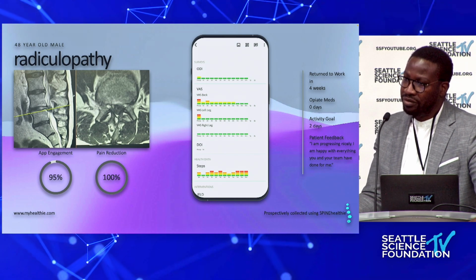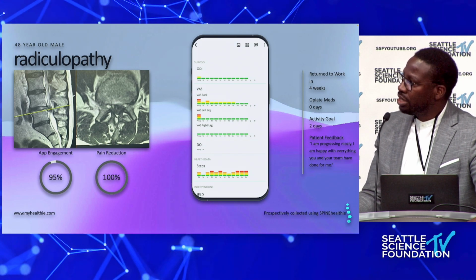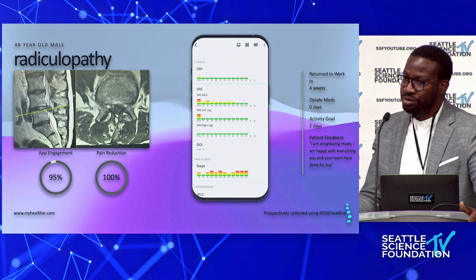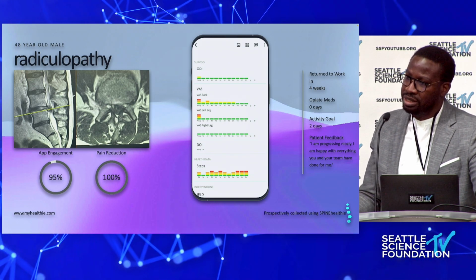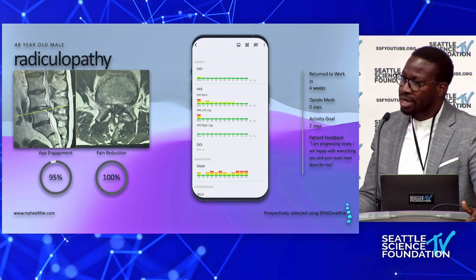And I think the timing of it, the ability to say, for the patient that is a little bit larger, what is the best option for you surgically? Can I do something with a tube? Sure. But look at those facet joints. If I start to take off too much of that, and this is a large BMI patient, now I'm potentially creating some iatrogenic instability further down the line.